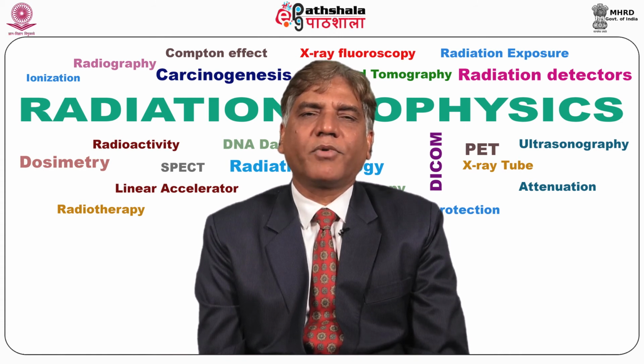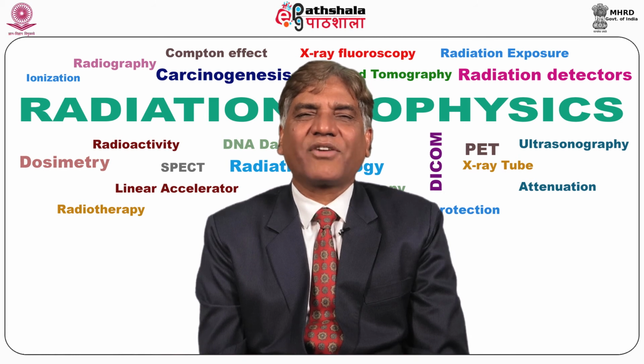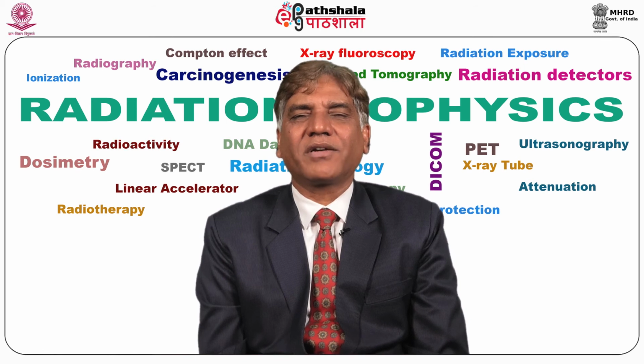Blood flow signal can be obtained from a range gate, but the disadvantage is that the quality of the pulse wave Doppler signal may suffer from background noise caused by switching circuits between receiver mode and transmitter mode, and we have a problem of aliasing, which is called the Nyquist limit, and this aliasing may produce a kind of artifacts in the image.